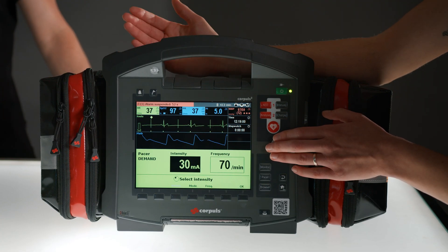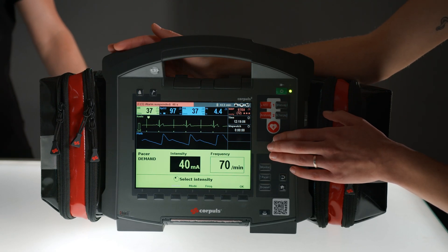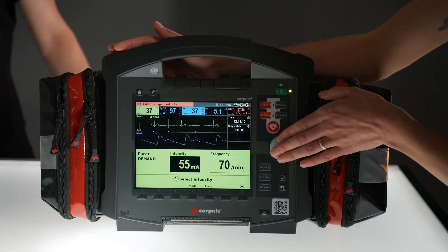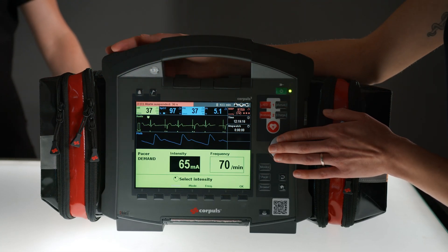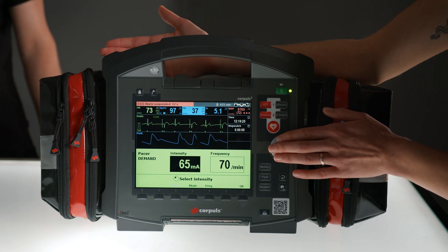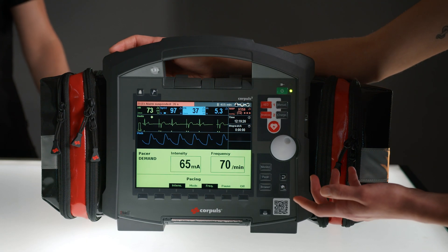We slowly increase until we can observe capture. An electrical capture is not always the same as a mechanical capture. To check that, I still have to palpate the patient's pulse. Ideally, this should be done at the radial or brachial pulse, or in the groin — not at the carotids.